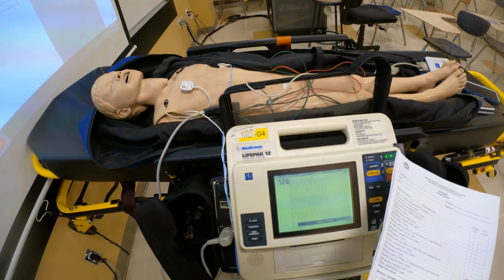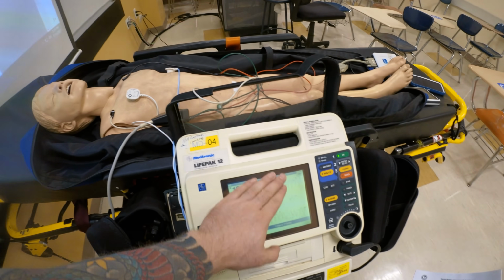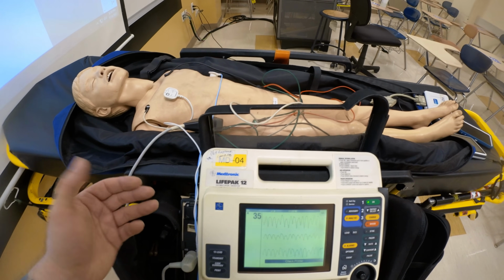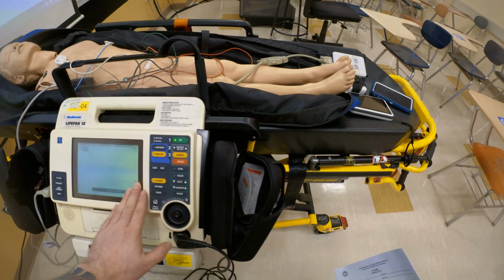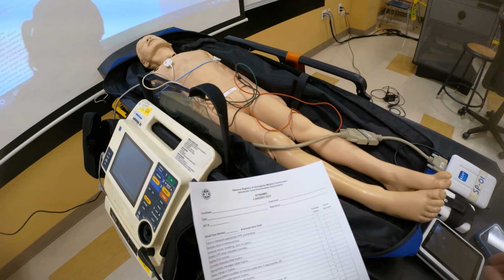The reason why this is important is that they start doing the skill, and all of a sudden it says connect pads, but they seem to be connected and the student doesn't know what's going on. So you definitely want to, in practice, show them how it connects and hear the audible clicks. So this is very important. Employ a monitor that is fully functional and able to carry out all the energy settings.